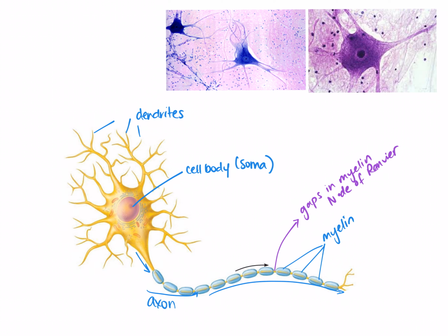So finally, at the end of the axon, we have what's known as the axon terminal. And this is where we're expecting to see synapses, either with another neuron or with a neuromuscular junction. So Vithya, is this a specific type of a neuron that we're looking at over here? I'm glad you asked, Daniela. So it's a multipolar neuron.